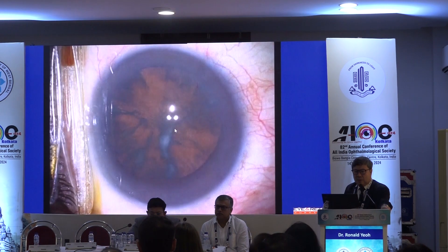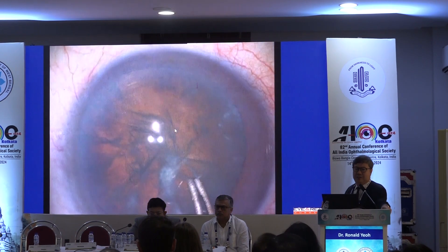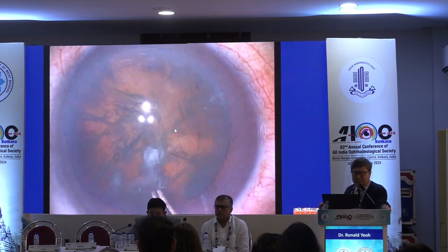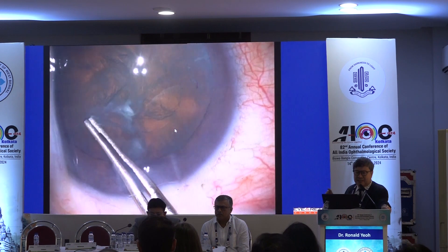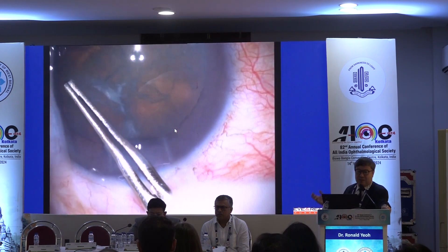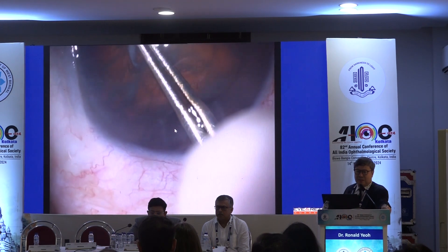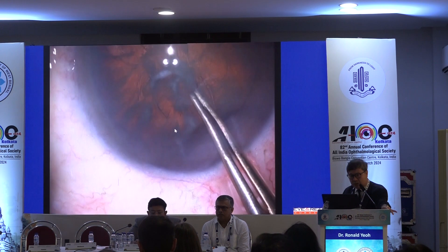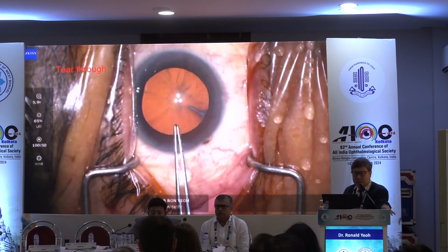What about when the fibrous track runs across the CCC line that you're going to take? You can see here I'm going to aim for the thinnest part of the fibrous plaque and see if I can tear either through it or over it. And here you can see it's actually gone through that fibrous band quite easily, getting a good outcome. But you've got to be careful — when you approach the fibrous band, just be slow and steady.